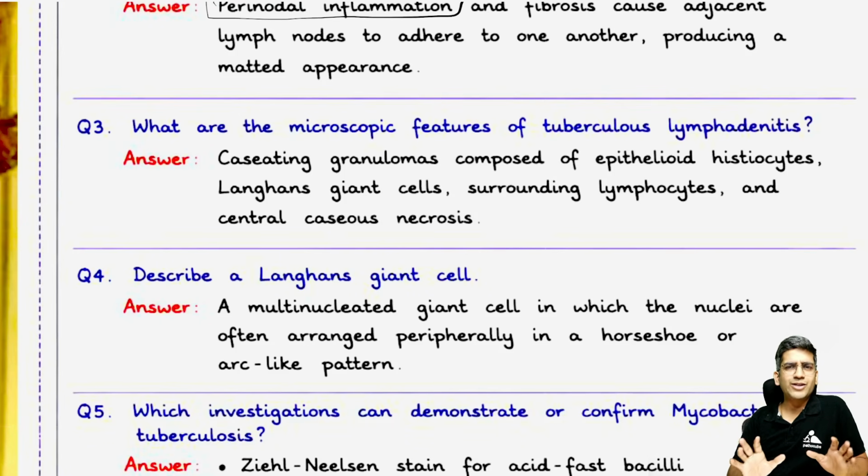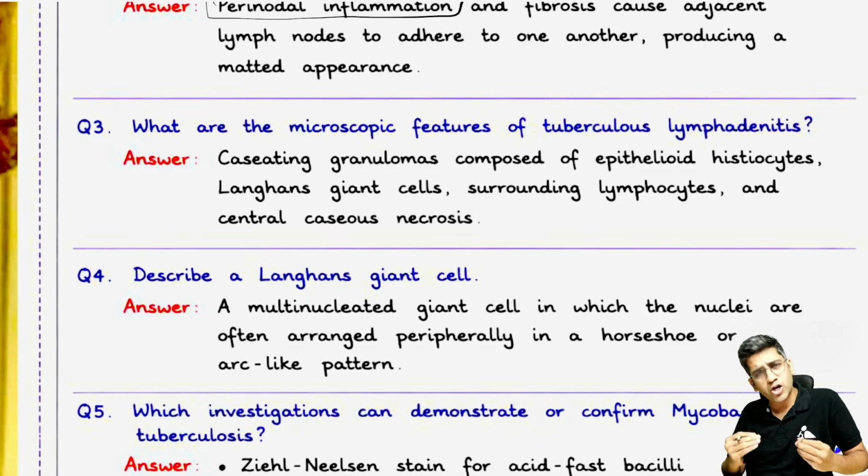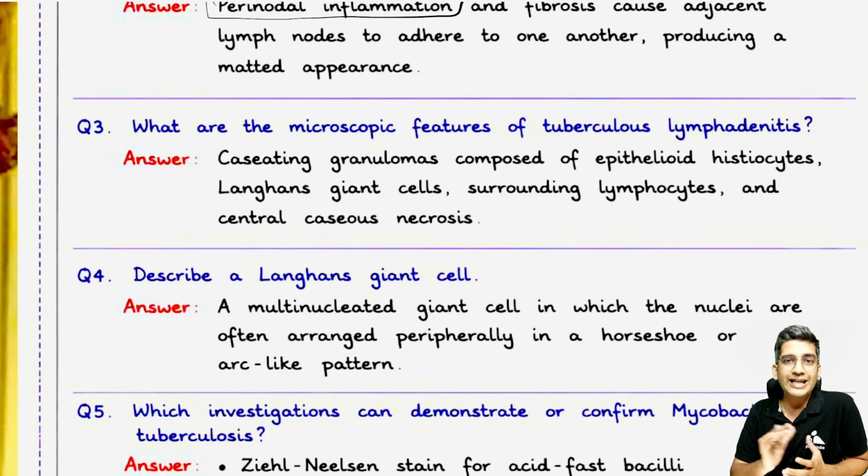Microscopy of tuberculosis: I will have caseous or non-caseous necrotizing lymphadenitis, right? You'll have caseating granulomas which might be coalescing. Coalescing caseating granuloma is a classical finding for tuberculous lymphadenitis. Before they ask the next question, where do you see non-caseating lymphadenitis or non-caseating, non-necrotizing granuloma? I want you to tell that upfront.